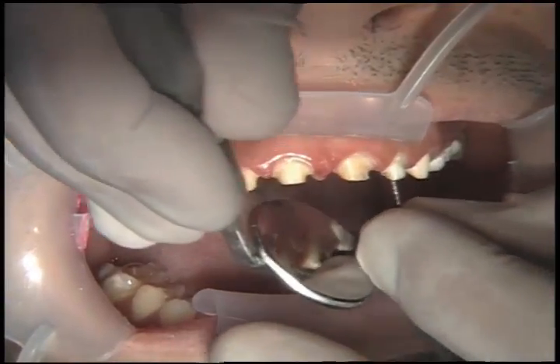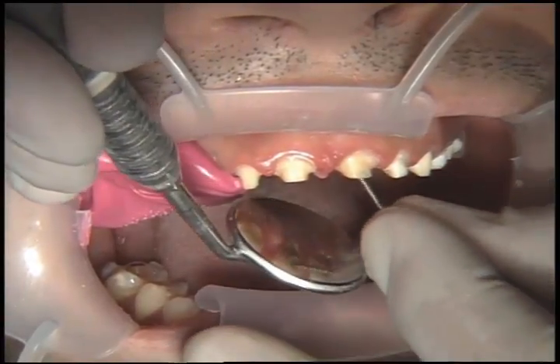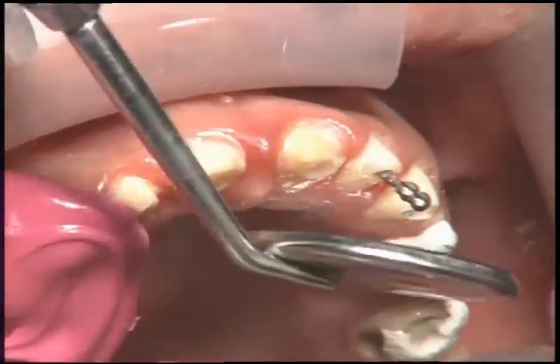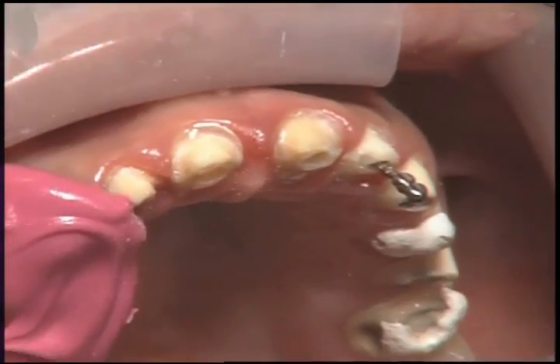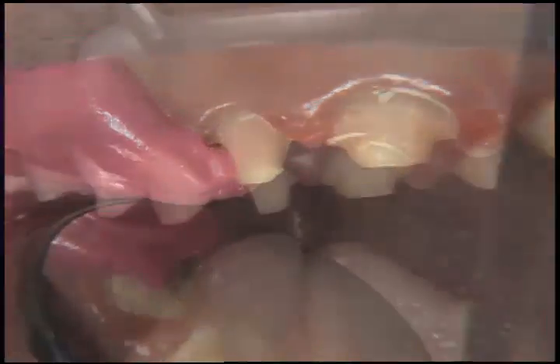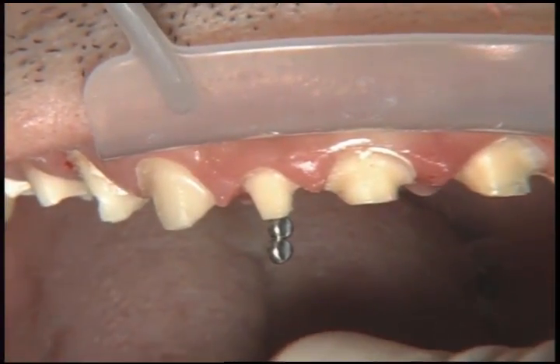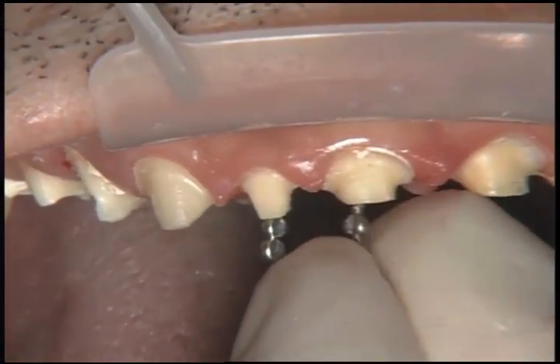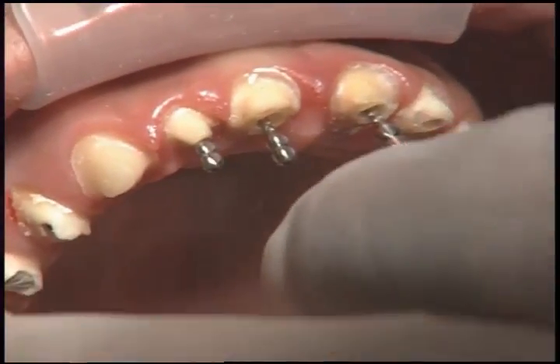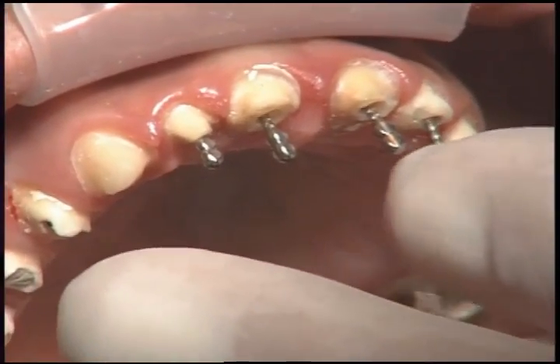These teeth have been endodontically treated about a year ago as a result of his GERD condition as well, and we're going to take advantage of that by placing some titanium posts and some composite buildups so we can get more mechanical retention to help hold these crowns into place. When you see biotemps come off when they're splinted — four, five, six teeth together — you know you're getting more retention than you will with single units, even though they're only on with temporary cement. So if biotemps are chronically coming off when splinted, we know we have a problem. We're going to put some post and cores in place and gain some length at the incisal edge of the teeth.